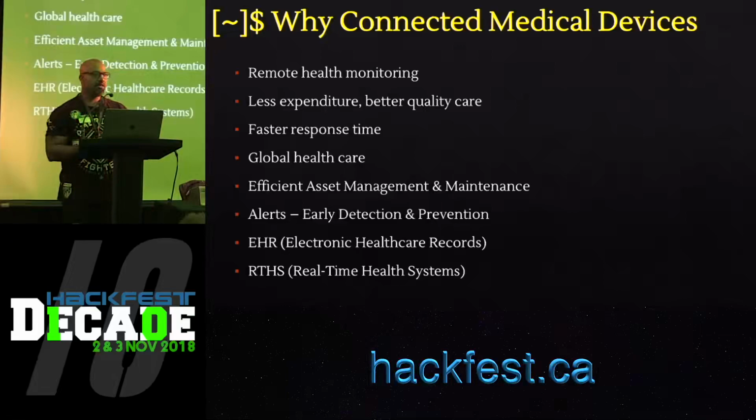There was a message type 2, which confirmed to the pump that it is now connected to the pump server. So if we receive a packet from the infusion pump, modify it, and send a message type 2, it'll confirm to the pump that it is now connected to the pump server. There were message types 7 and 31, which we're not really sure what they were. Message type 8 was usually followed by message type 2. Once you send those messages, it changed the status on the infusion pump from listening to confirmed. Message type 20 was something to do with network commands, and message types 208 and 238, we're not really sure.